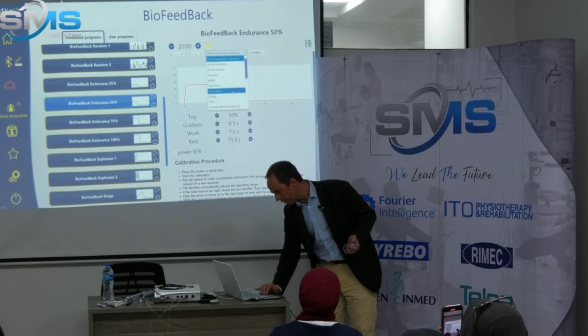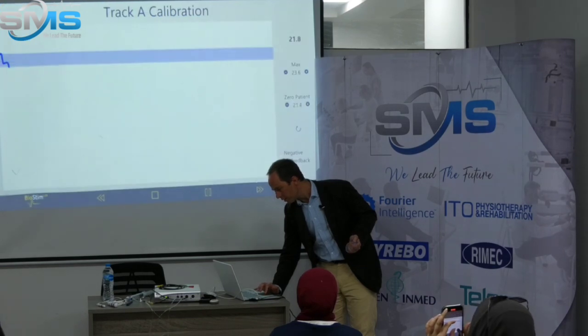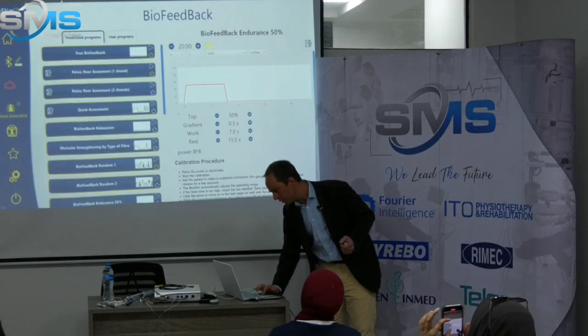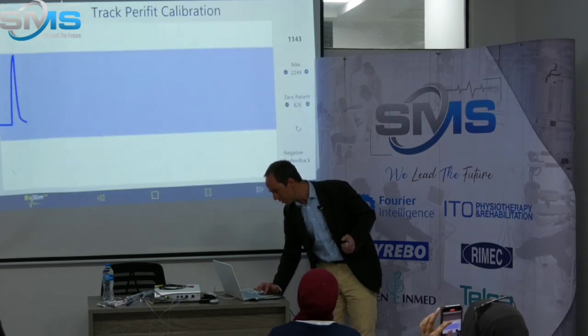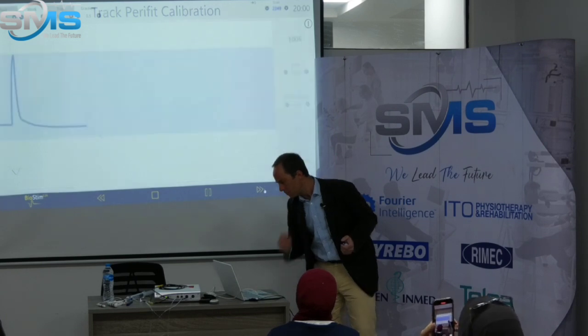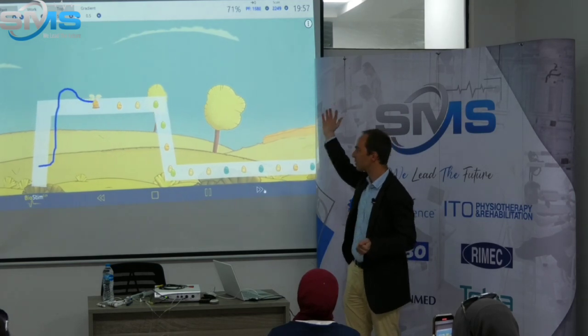So I'm choosing whatever animation. Okay, sorry. So I'm choosing this animation, and now, okay, we start. Now my patient has to catch some objects, whatever.